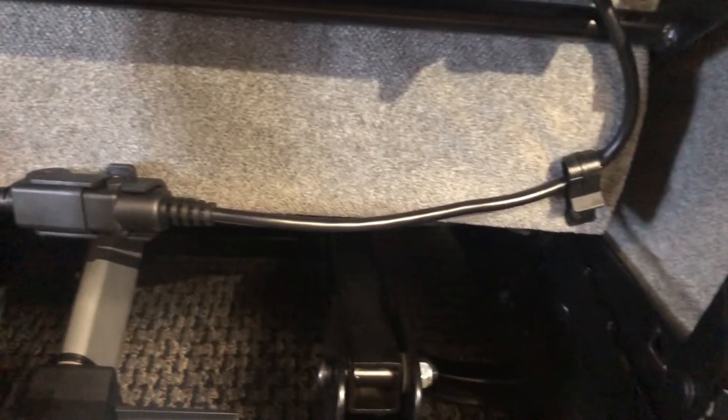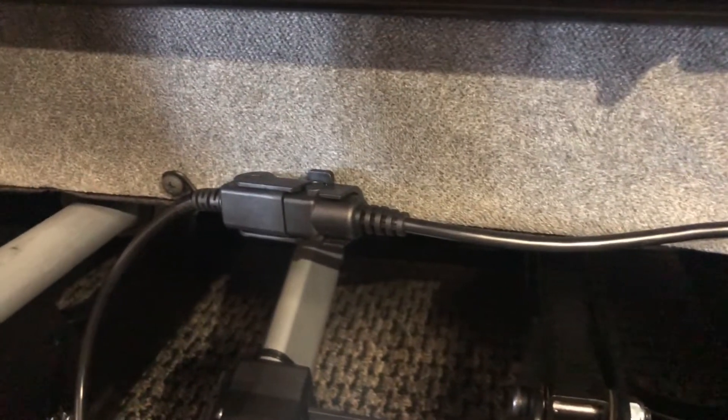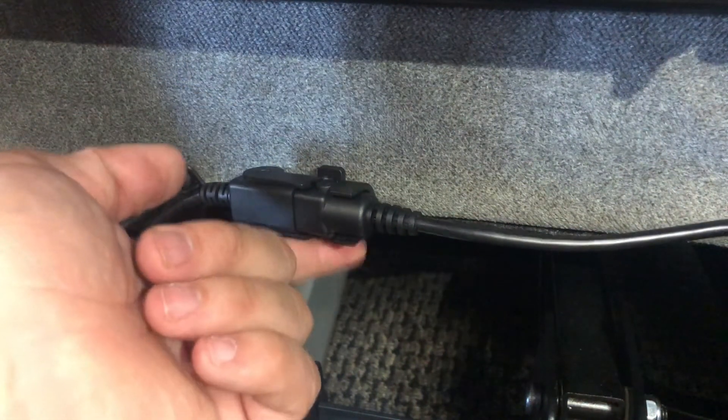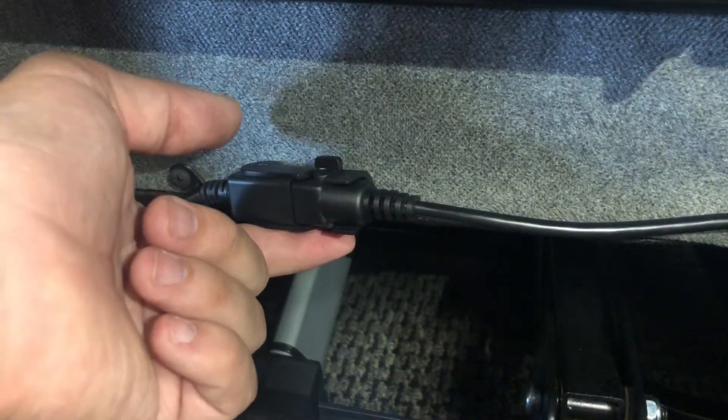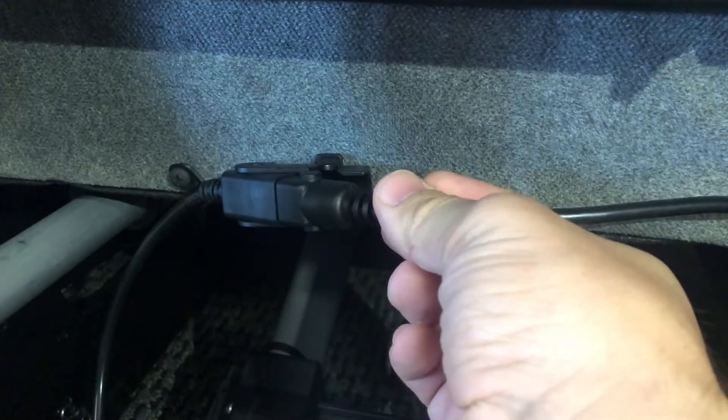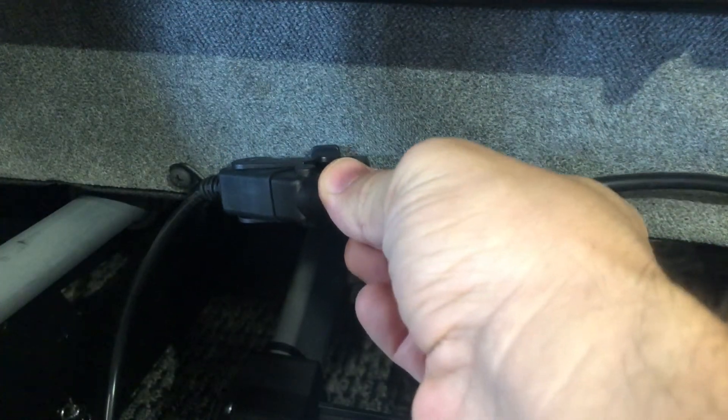For remotes that go between the backrest and the seat pan, locate the connection point on the back of the chair. The clasp will again have two tabs, which allow you to easily open the clasp. Once opened, pull the cord to disconnect the remote from the chair.